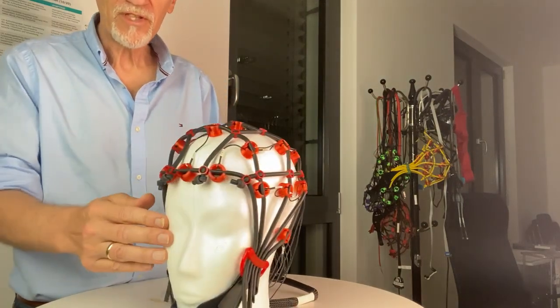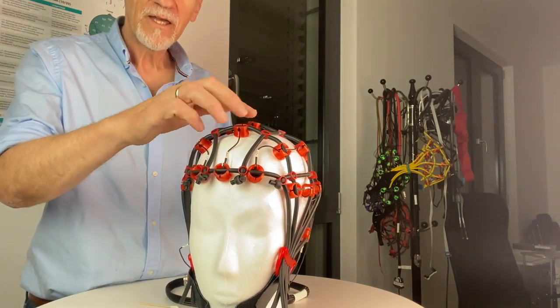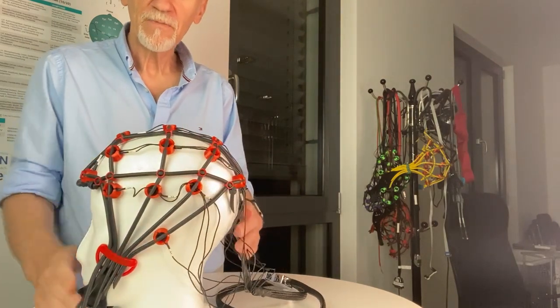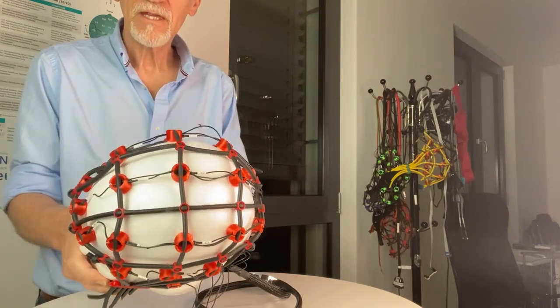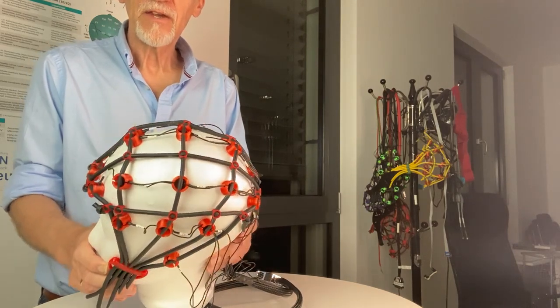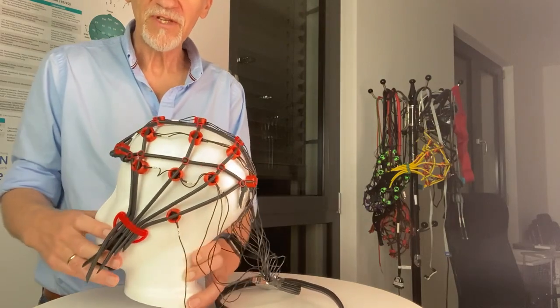The most important line is the line from nasion to inion — it goes like this. There is another very important line: the one from T3 to T4.